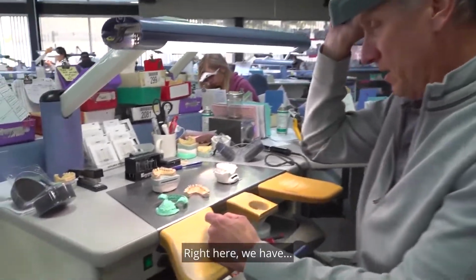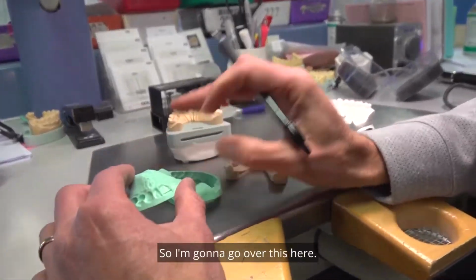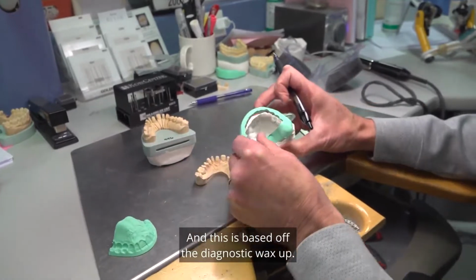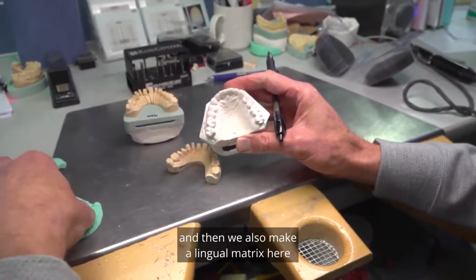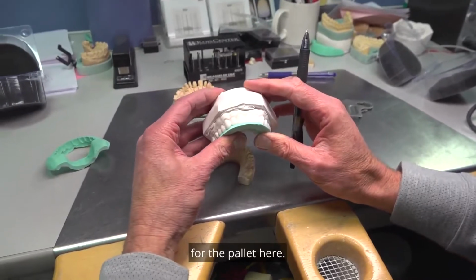Right here we have our prep guide, and a lot of people don't quite understand the way to use this, so I'm going to go over it. We've got the facial reduction here, and this is based off the diagnostic wax up. Once we get the diagnostic wax up made, we make a putty matrix for the facial, and then we also make a lingual matrix for the palate.